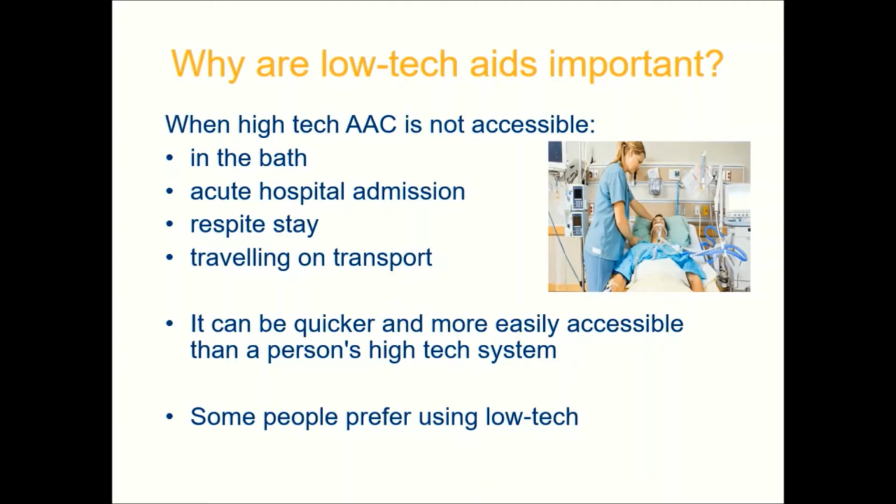Some people feel that low tech is actually quicker for them than having to use a computer where you have to turn it on and wait for it to load and then set up your switch or your eye gaze. Some people find it a lot of hassle and actually they just prefer using something simple and robust like a paper chart.